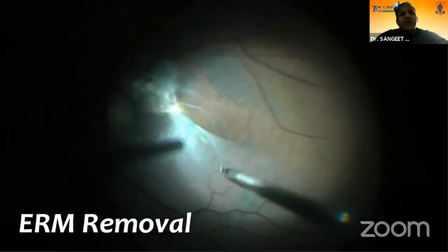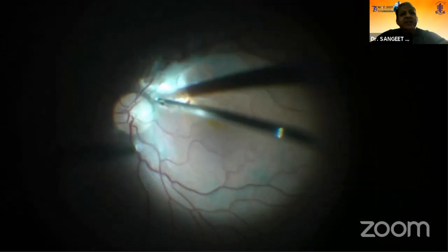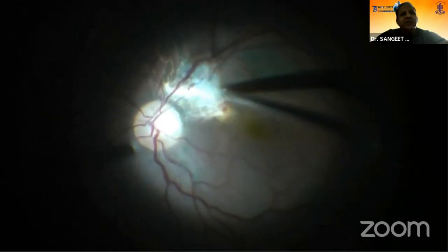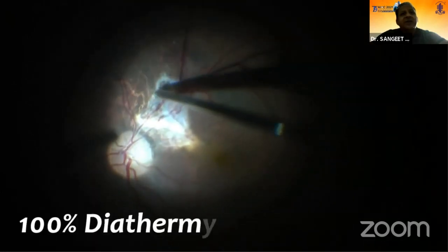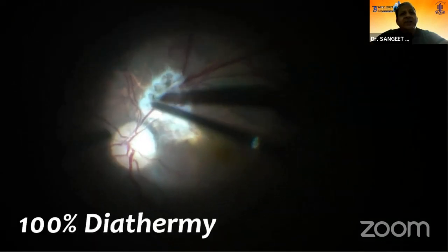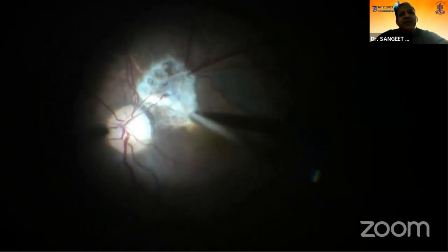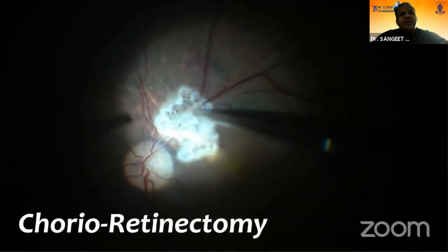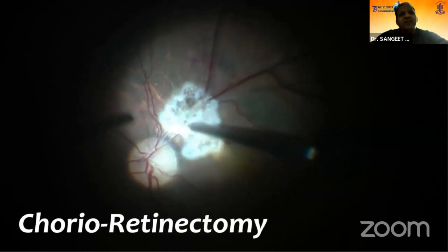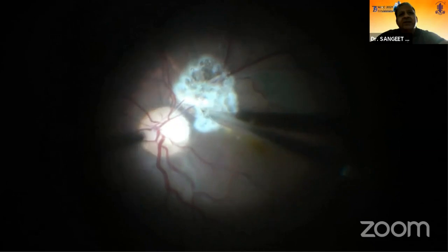We removed the epiretinal membrane and then we trimmed it. You see the membrane was extending into the subretinal space. We trimmed the membrane. We applied 100% deep diathermy burns, sparing the major retinal vessels. And after this, with the diathermy itself, we tried to melt off the choroid as much as possible. Whatever was left was eaten up by the vitrectomy cutter.